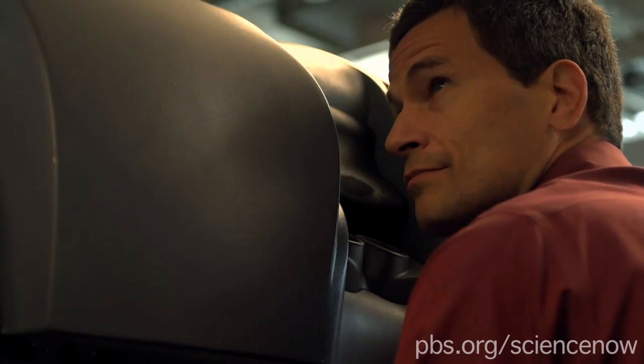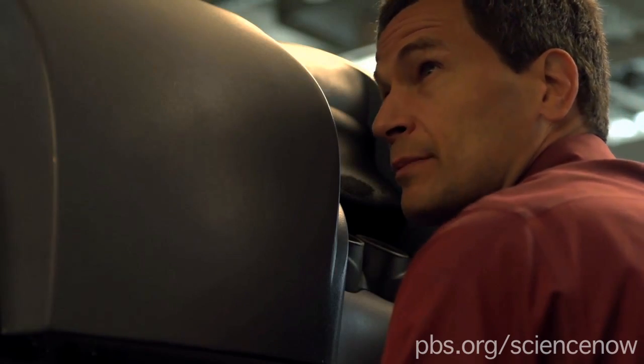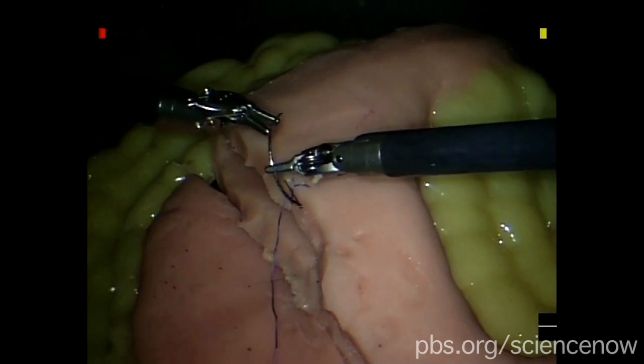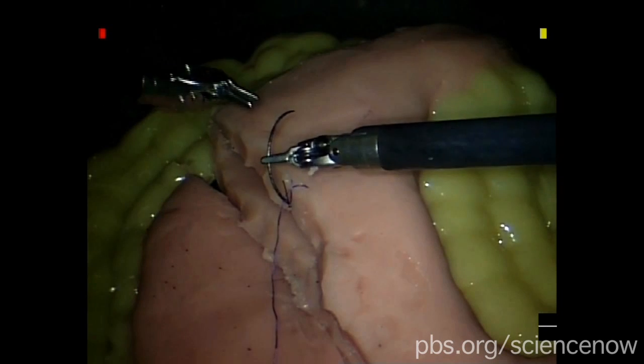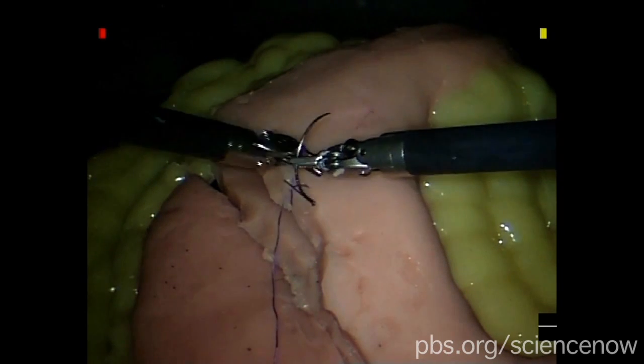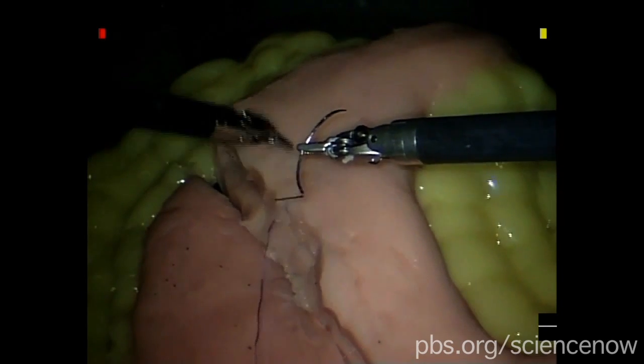Yeah. There's a tension, which is critical for a seamster like me. I even feel what materials feel like. The little needle feels hard and springy and the stomach tissue feels mushy.